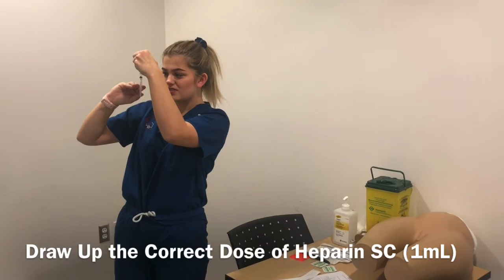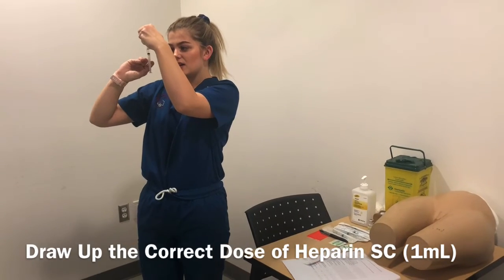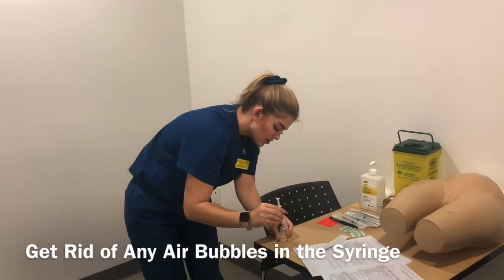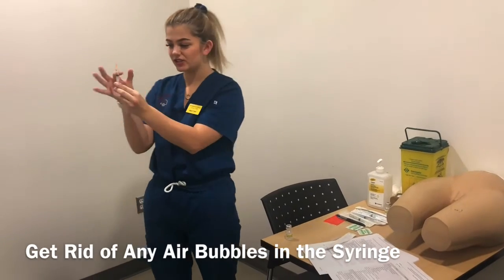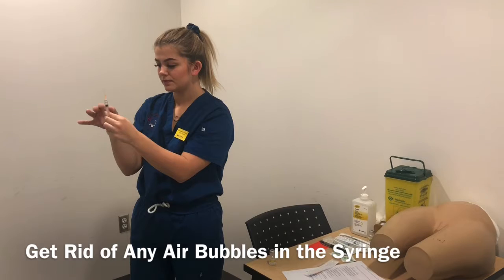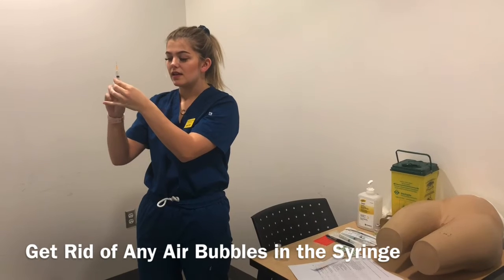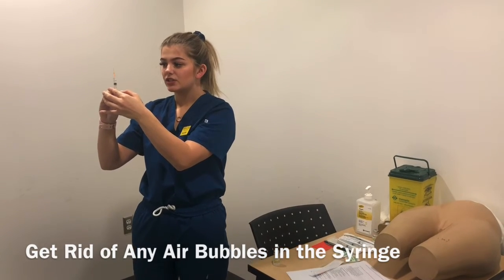Just want to make sure there's no air bubbles in here. Okay. So now I'm going to set the syringe back down, pull it out. And if you see any air bubbles in your syringe, you just kind of want to flick them to the top. And then pull back on the plunger slightly, and then expel the air out of the top of the syringe.